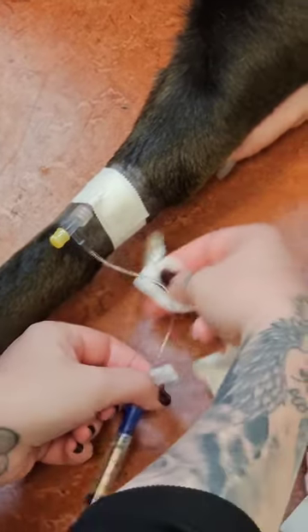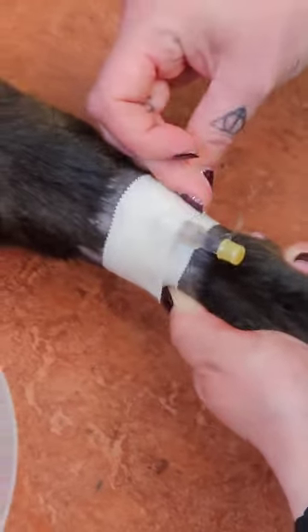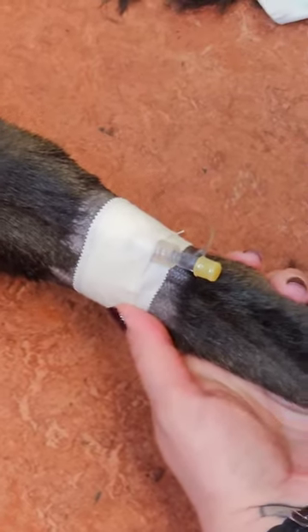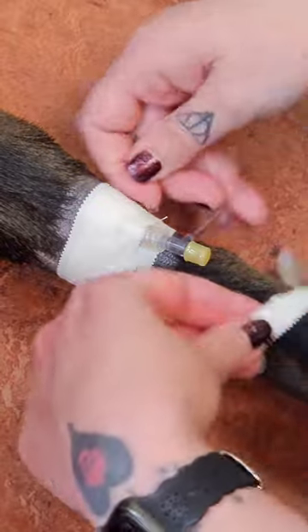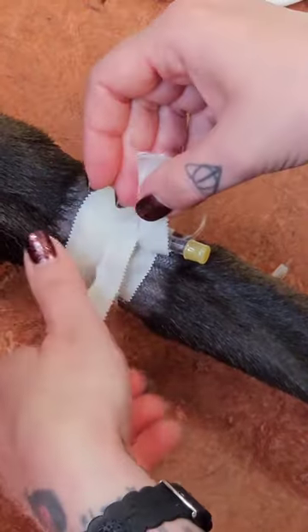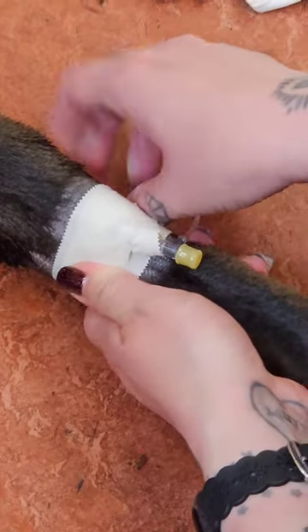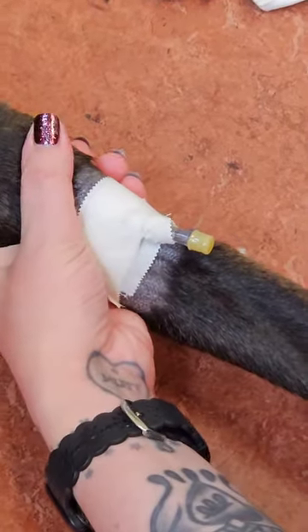Taping varies. It's best to not tape too tight or else you'll have a fat paw situation, but you also don't want to tape too loosely or else the catheter is going to come out. This is a nice tape job here — laying it on firmly but not too tight. That is an anchor piece going under the catheter that helps stabilize it from left to right movement.